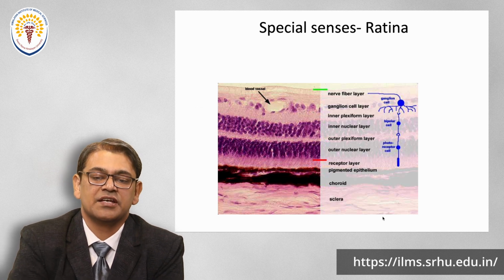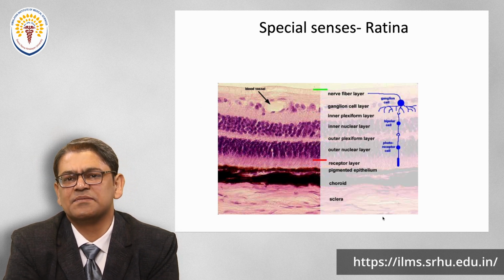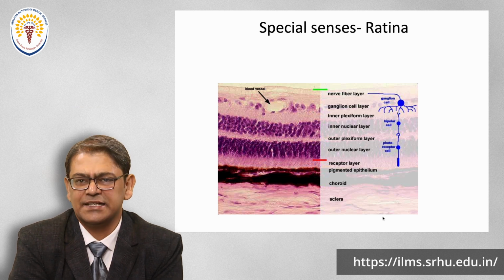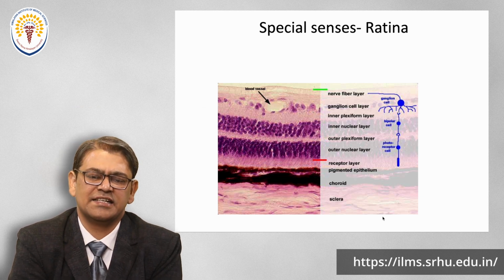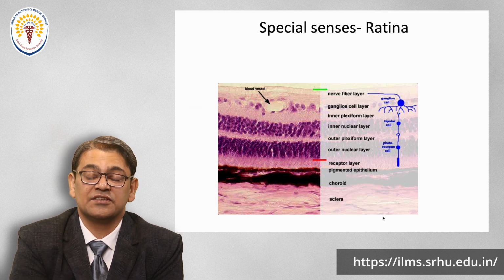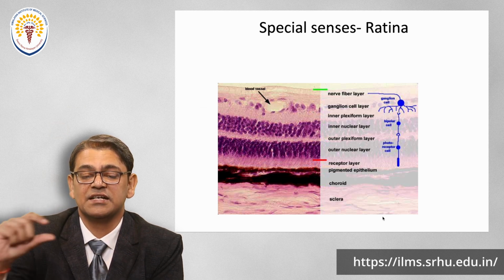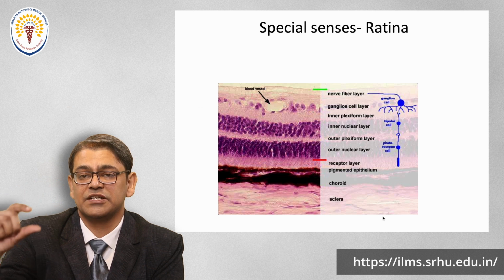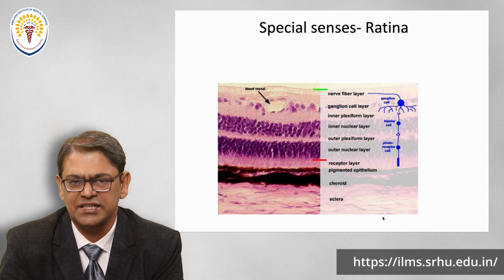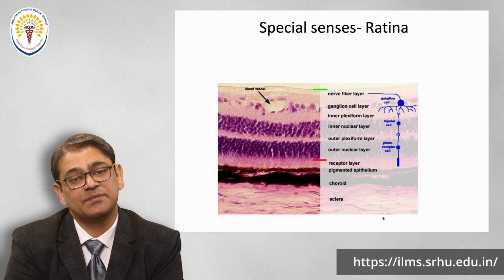Understanding the retina with H&E staining is a little bit unfair to the student, because the retina cannot be visualized completely or given its complete histological analysis under H&E staining. In H&E staining, though, it has a very peculiar pattern of nuclei, multiple double rows of nuclei, that gives you a very clear idea that this is the retina. Once you see it, you never forget that this is the retina slide, but if you go into the depth, it's a bit challenging.